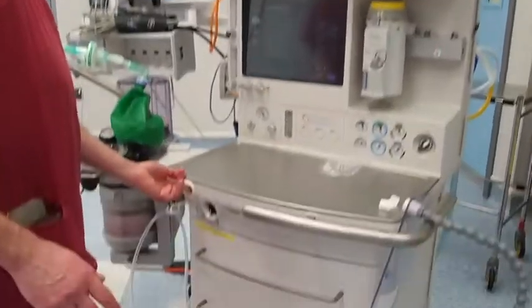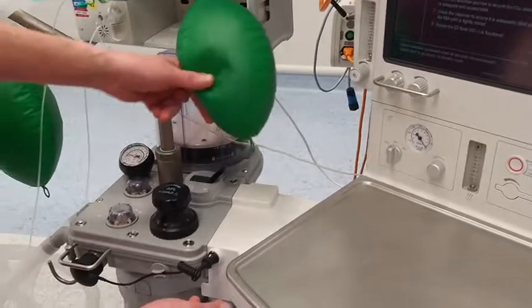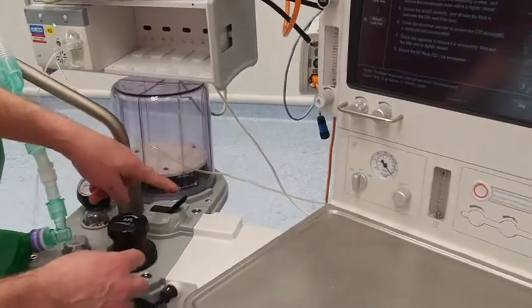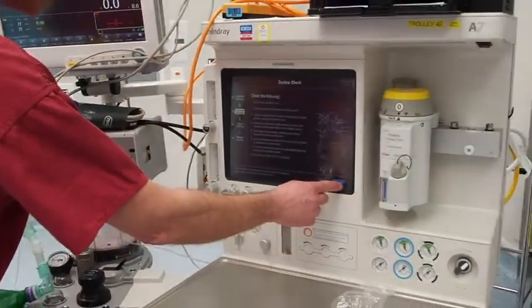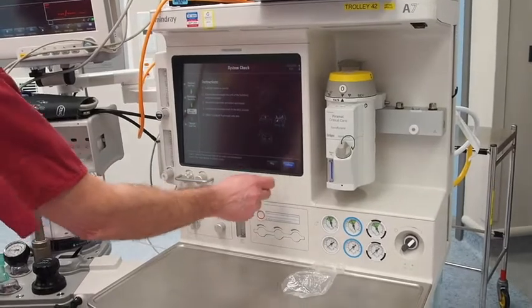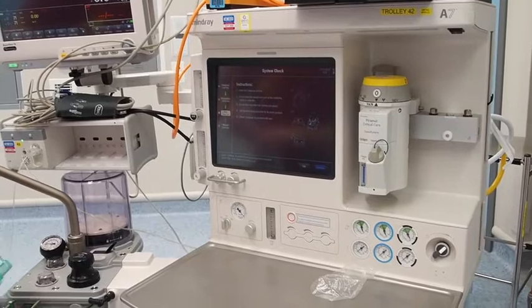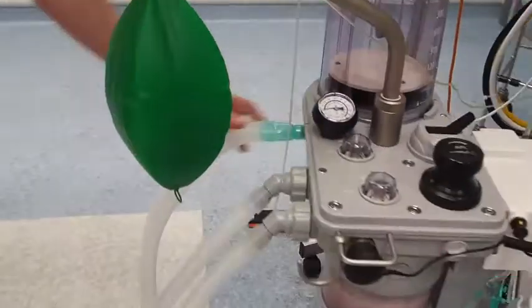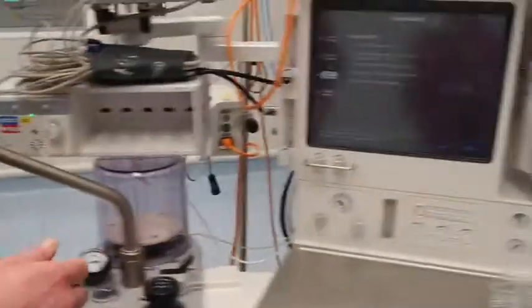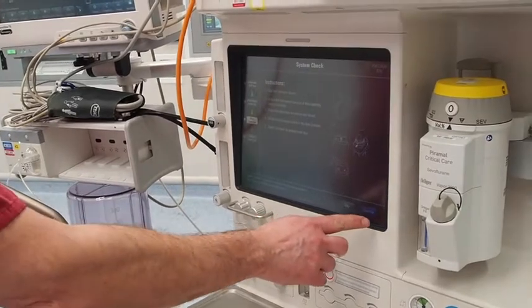Use this O2 flush button here. This will fill up the bag, and this is with everything set onto the manual circuit here. Press continue, and it just works itself right through the self-test here. So the white piece plugs into the block here. And then we just press continue.